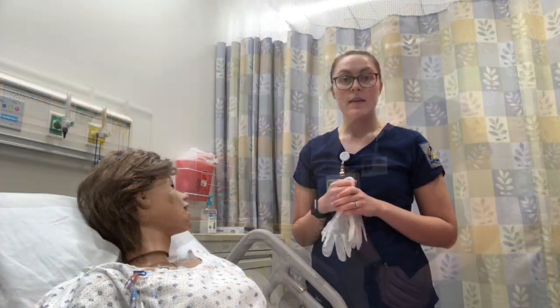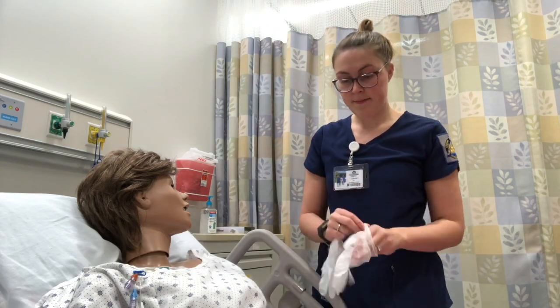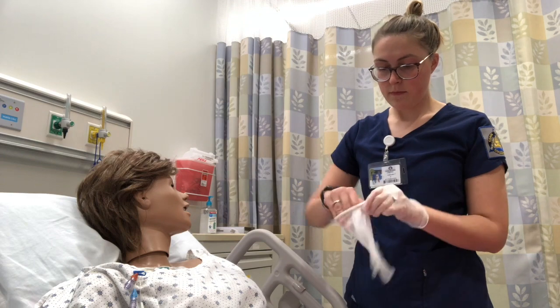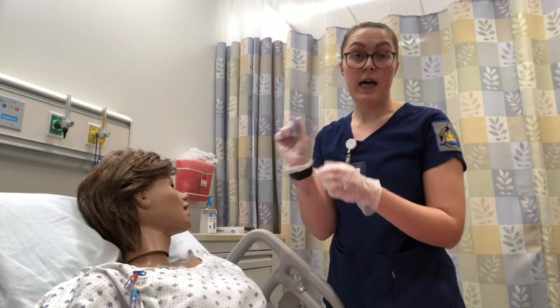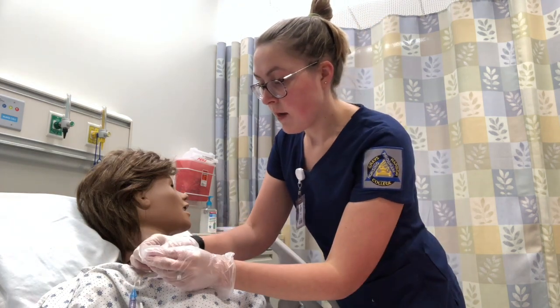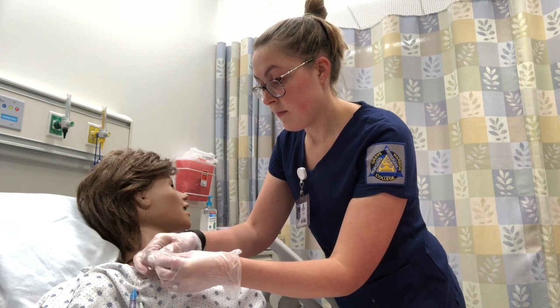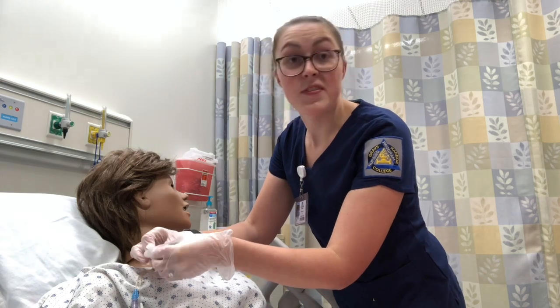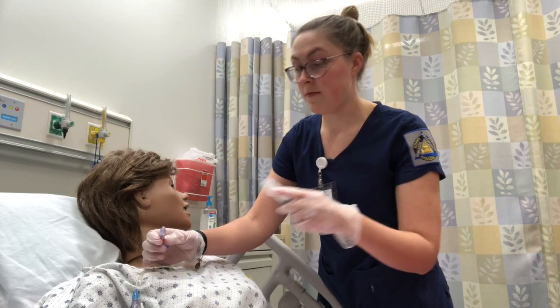So we're good. I've now washed my hands, and I'll proceed by putting my gloves on and scrubbing the hub of the port for 15 seconds with the alcohol prep pad that I grabbed earlier. I'll be using the distal lumen in order to give this medication. That was 15 seconds. I will now administer 10 milliliters of sodium chloride or normal saline flush.